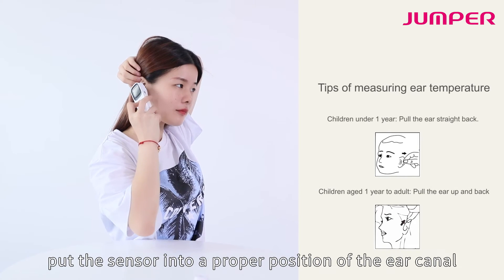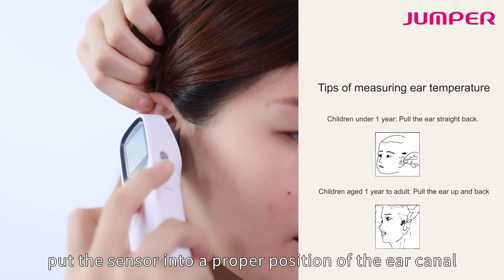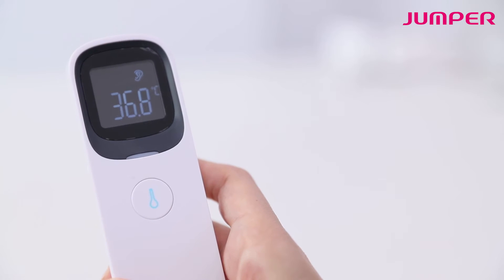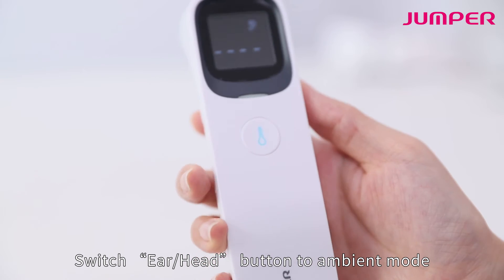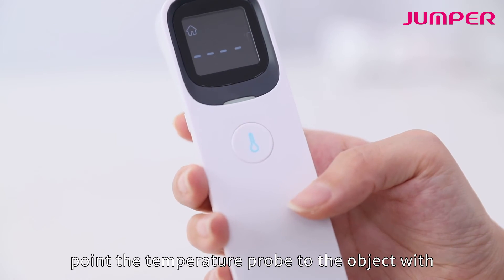For ear temperature, switch to ear mode. Take off the probe cover and put the sensor into a proper position of the ear canal. Press the measure button to take a measurement.